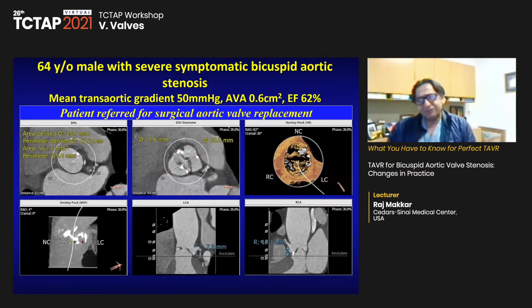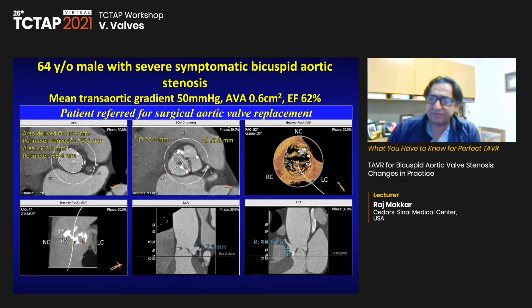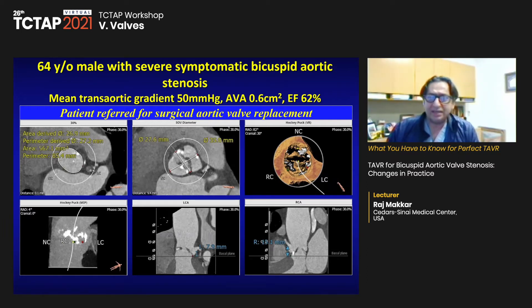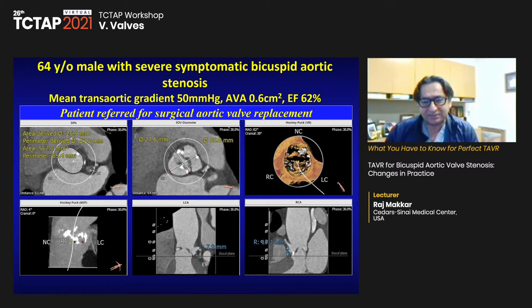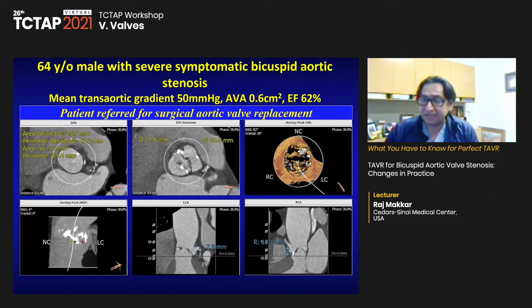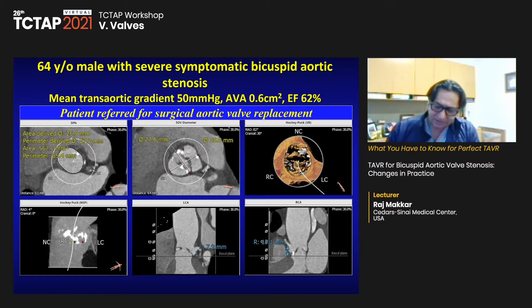Let me share some case examples from our cath lab. Here is a 64-year-old patient with severe symptomatic bicuspid AS. The left main height is only 7.9 millimeters, so doing a TAVR would clearly impact the ostium of the left main coronary artery. In this case, we decided to send this patient for surgery.